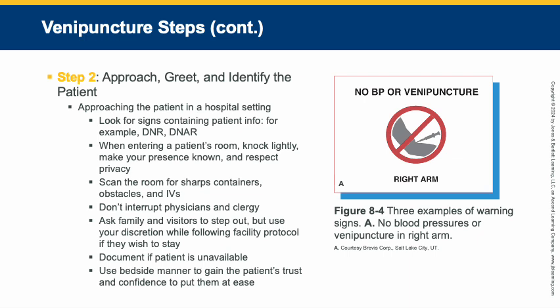Scan the room for sharps containers. You need to know where the sharps are because you're going to have needles you got to throw away. Any obstacles, make sure you're not going to be caught up in any wires or anything over there by their bedside or IVs. Don't interrupt physicians and clergy. If physicians or clergy are in the room and you need to draw blood, then you can go on in and draw that blood, but don't interrupt the physicians and clergy if it is not necessary, okay?